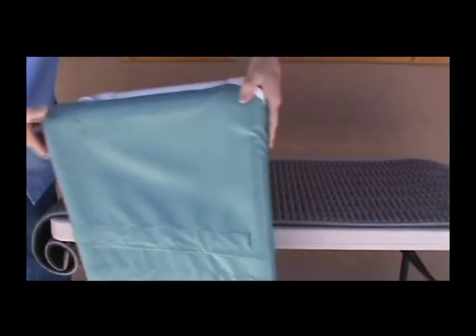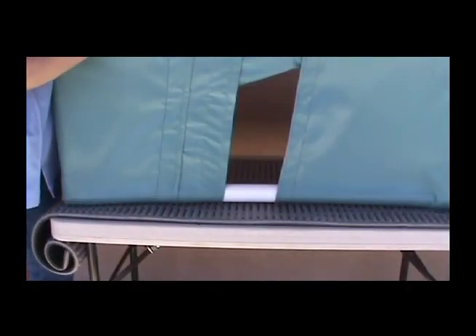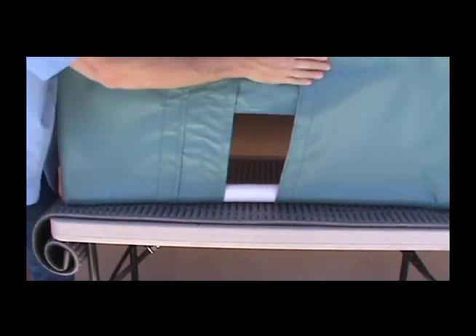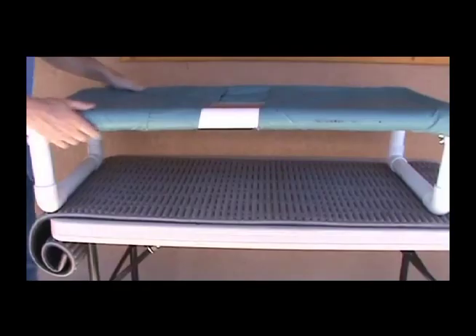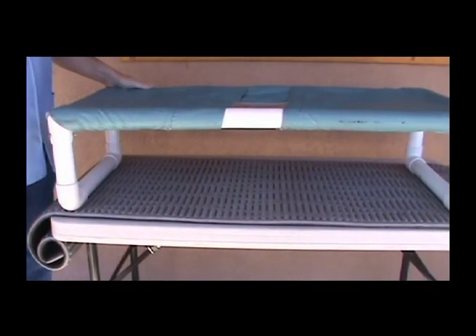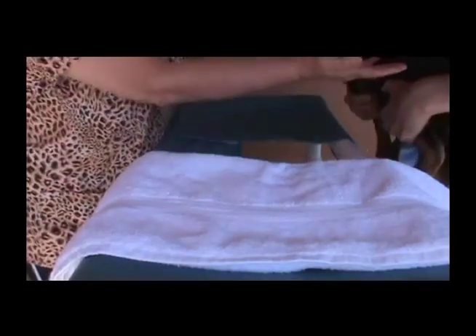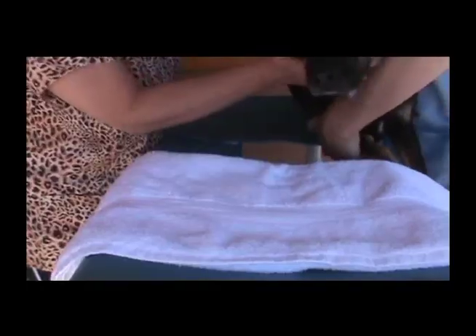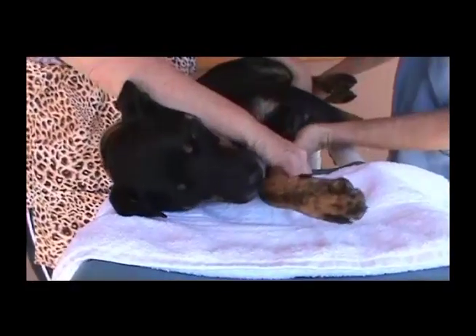The cardiac table is placed on the ultrasound table and then the patient is placed in right lateral recumbency with the shaved area of the thorax over the hole of the cardiac table.